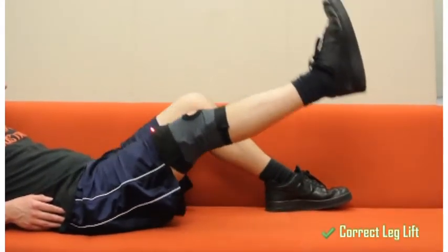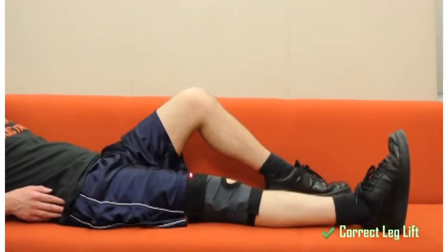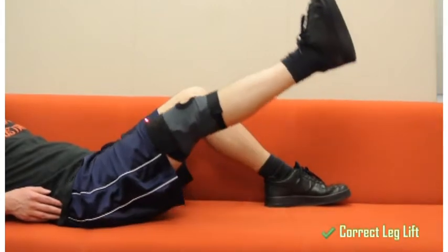When a patient keeps their leg straight and raises it to the appropriate angle, the knee brace will acknowledge their gesture with a beep and keep a running count of the exercise.